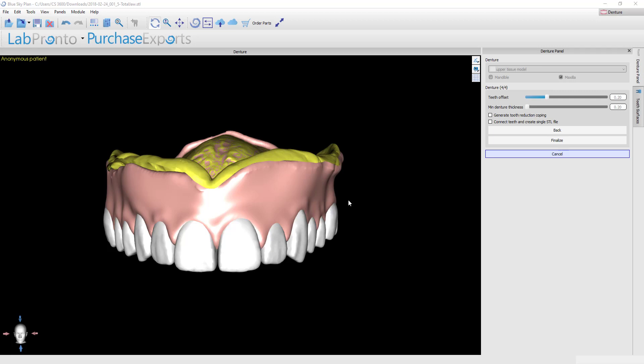We're now in the home stretch and we'll finish this denture fabrication. Once you are finished with all of your gingival festooning and you're happy with the denture base and the tooth position, we can do the final step and process this denture into its completed form.